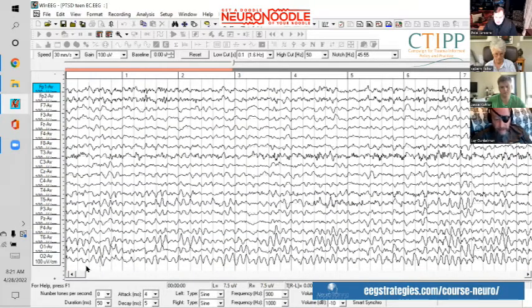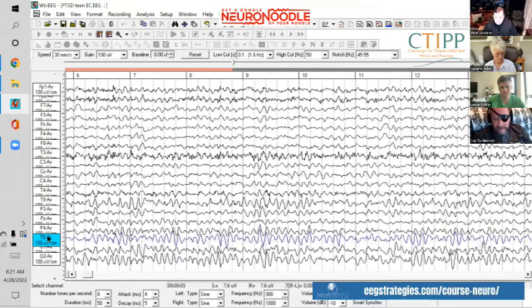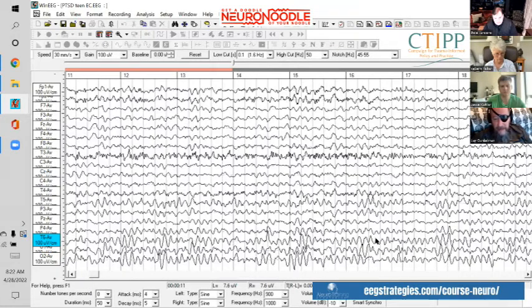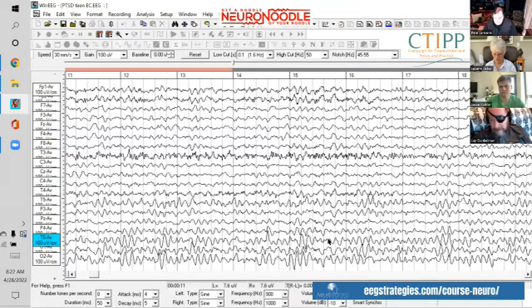This is a nice closed-eyes recording. As we scroll through the EEG, the right posterior temporal-parietal area here isn't supposed to have that much background alpha. Alpha should be at O1, O2, and a little PZ. But this right posterior temporal area that perceives facial expressions, body language, and the tone of speech — if that area is idled, you've basically turned off your sensitivity to emotion. Perhaps in a self-protective manner, but this has to be fixed in order for the person to not have PTSD on a chronic basis.